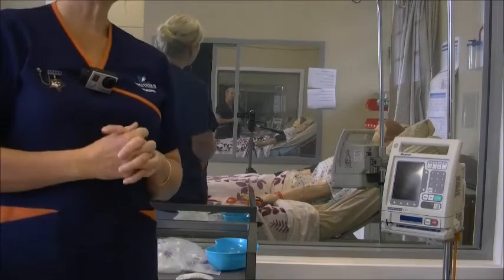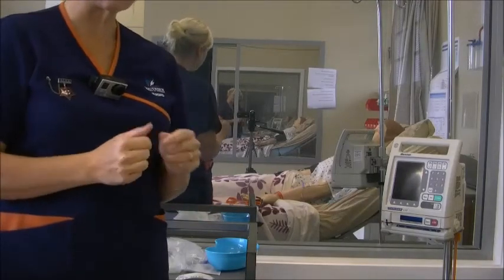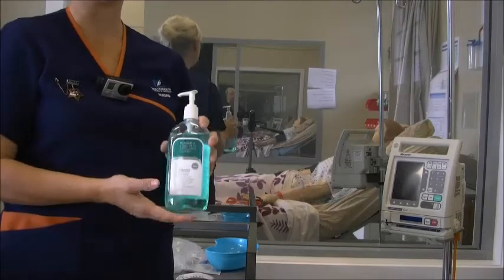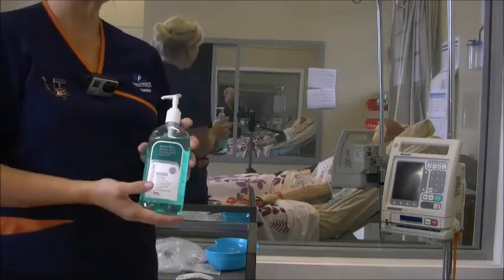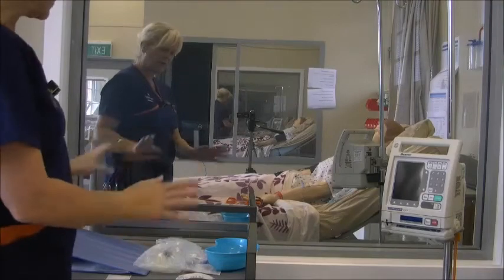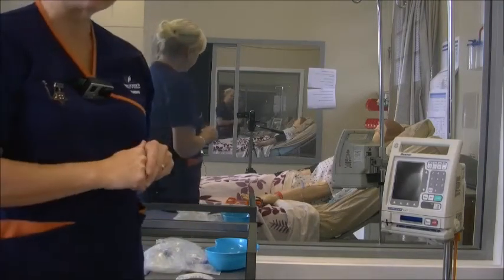Okay, so when I went away to get my equipment for this procedure, I washed my hands with gel. Remember that you can do that in between going to the hand basin to do a complete wash, but because I've walked away from my patient, I used the hand gel prior to setting up my trolley. When I got to grab my trolley, I gave it a complete wash from top to bottom before I put all my gear on there.